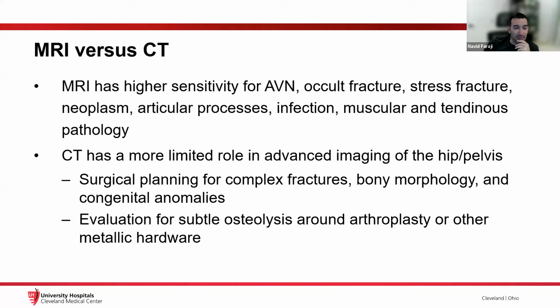We're not relying solely on cortical disruption or fracture deformities to see our abnormalities. In MSK imaging, CT is more limited, as you folks know, mostly done in the setting of known fractures for pre-surgical planning, or when X-rays were negative but MR is not available and we just want to see if there's some fracture that we might be missing. CT is good for that. But really, X-ray is the mainstay of musculoskeletal imaging, and then MR would be our next best test in many cases. And today we're going to concentrate on MR because that's what I'm told we're here to do.